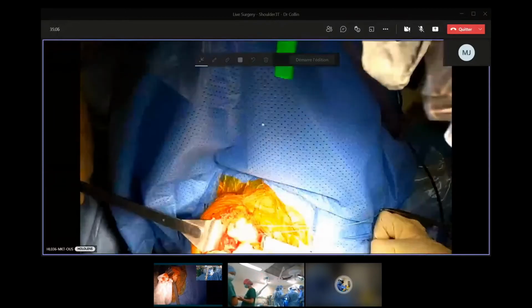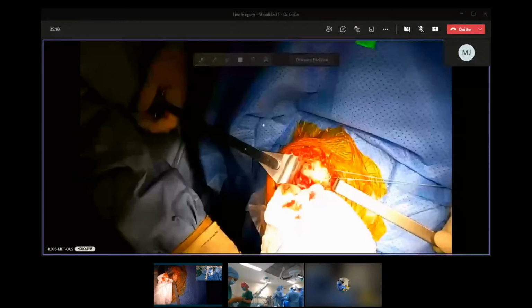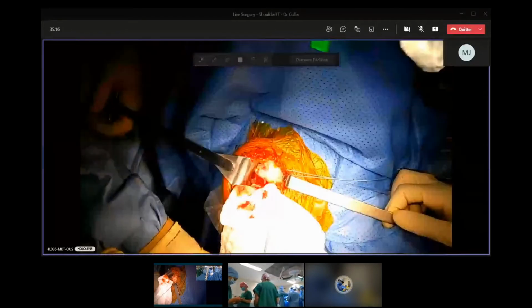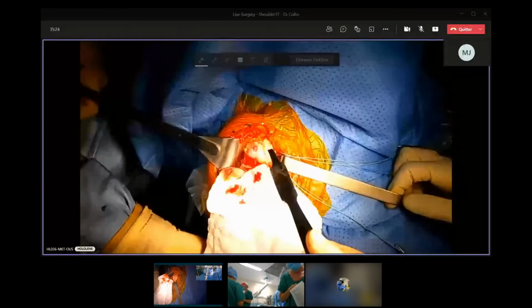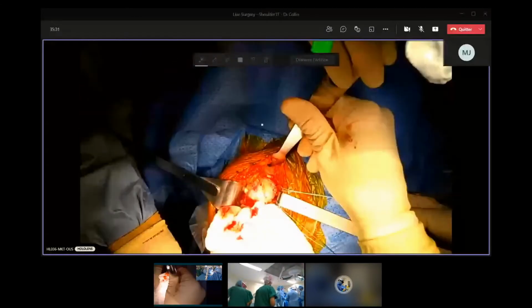I cut tendon to tendon. I will show you. Okay. Okay, Omar. Do you have a good visualization here? Perfect. You see the quality of the picture is perfect. So just because sometimes I don't remember to put my head very low, so just remind it to me.